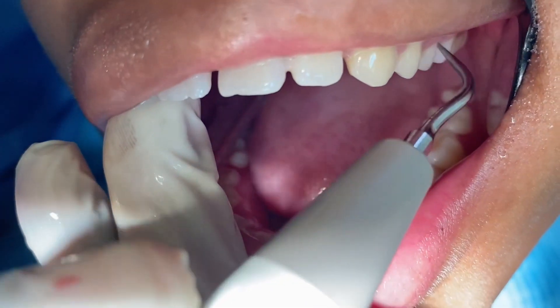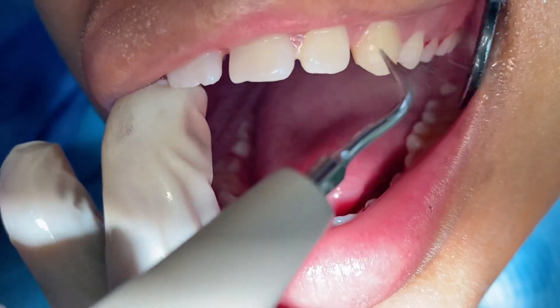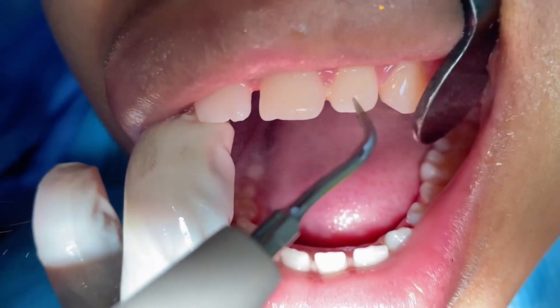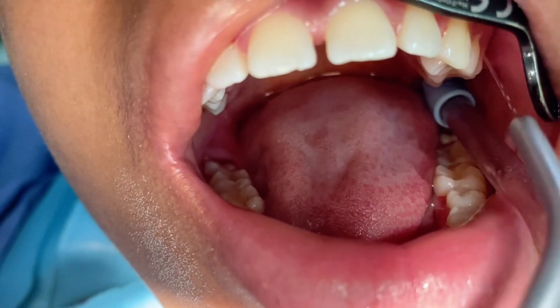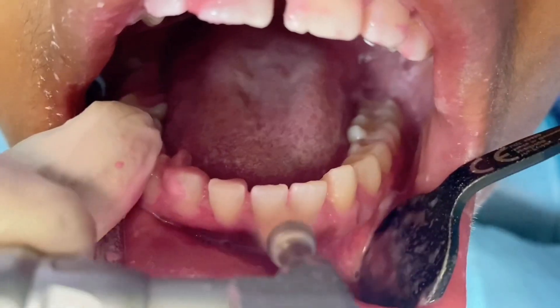This ultrasonic scaler uses a combination of ultrasonic vibrations and high-pressurized water to remove plaque, tartar, and stains. It is used on every single patient. During this procedure, your dental therapist or hygienist uses up and down strokes to remove the plaque, tartar, and stains on the surfaces of the teeth.